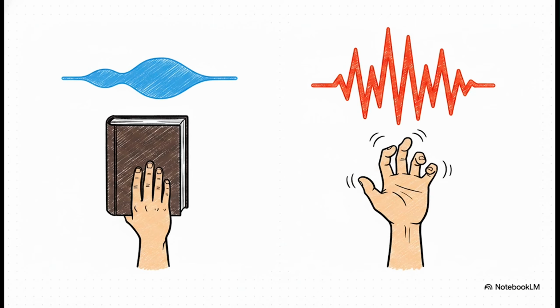But on the right, we have dynamic signal variations. Think of rapidly typing or wiggling your fingers. The waveform completely changes into wild, erratic spikes. Those visual squiggly lines are literally telling the story of what the muscle is physically doing.